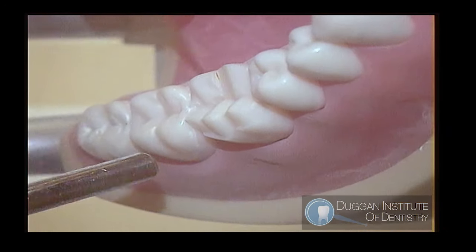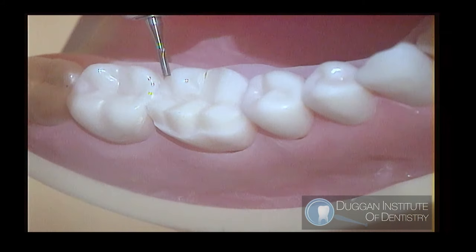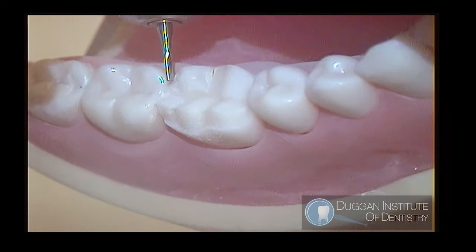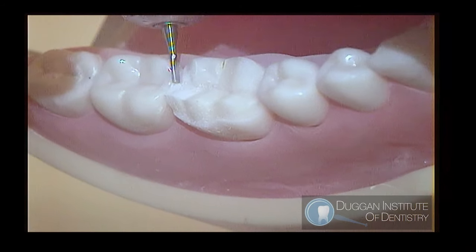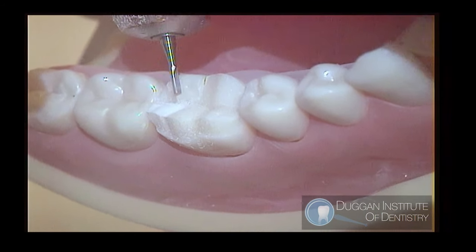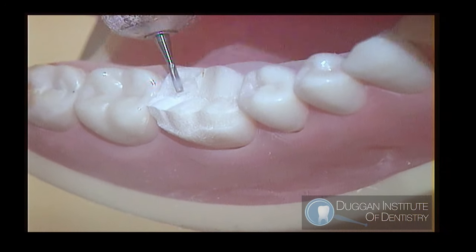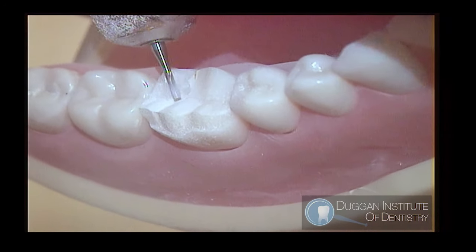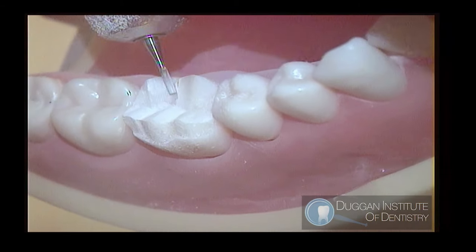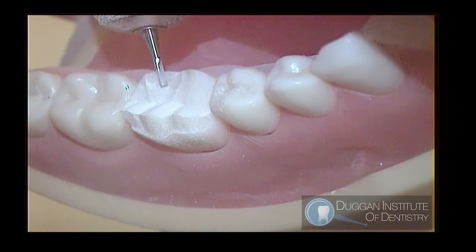Reduction of the distal lingual cusp. We reduce half of the cusp at a time. Place the burr parallel to the ridge, pointing towards the central groove. Gently reduce the cusp from the occlusal down to the central groove, creating a measurable ledge 1 mm to 1.2 mm. Reduce half of the cusp to the marginal ridge. Reduce the other half out through the lingual groove.